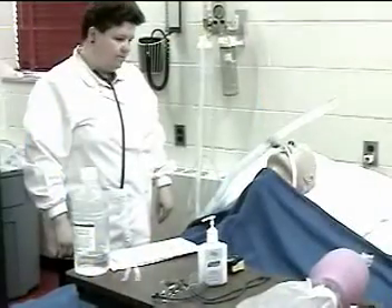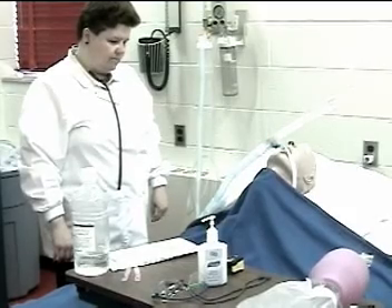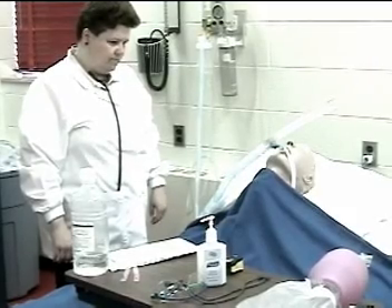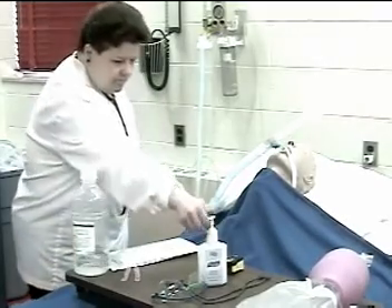This is a performance evaluation for endotracheal suctioning using the open suction system. Step one follows standard precautions including hand washing.